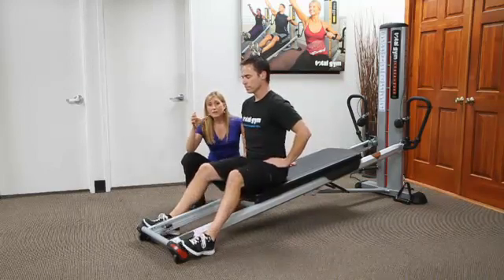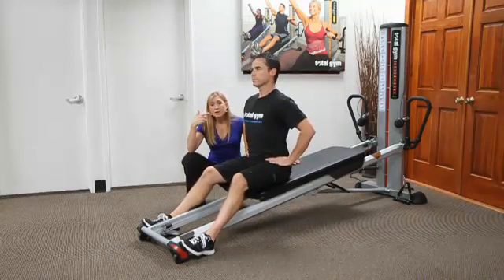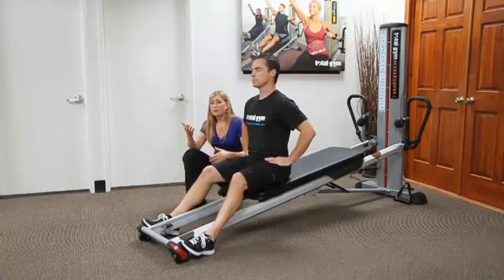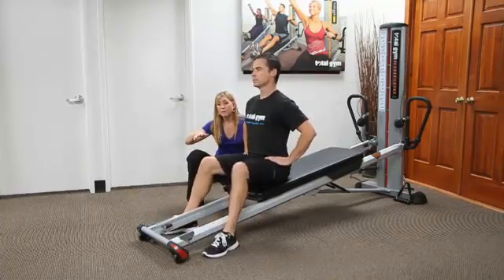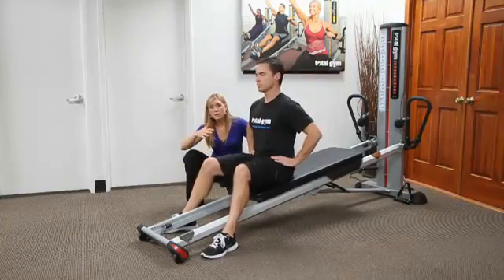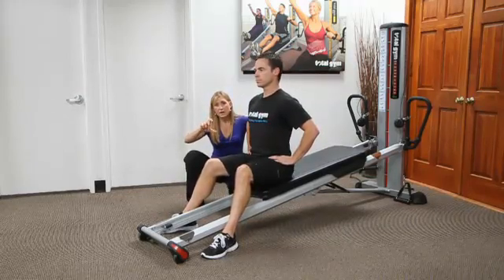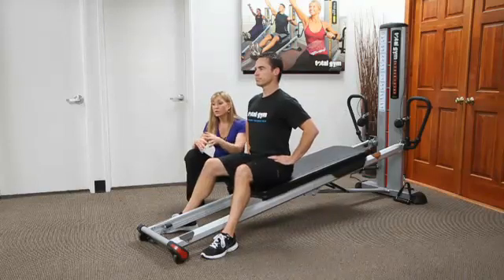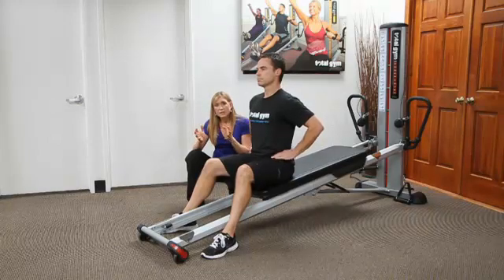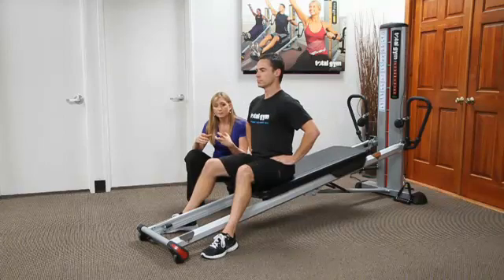And I use the fact that the board moves and he can tuck under and push back to allow him to develop the awareness of movement and isolation of the pelvis. Oftentimes, I really say, let's really move and let the glide board move and really kind of tuck under and back and let the entire body get into the motion, and then really tell, okay, keep the shoulders stable, and then just really start to isolate it out. It's nice because sometimes a ball has too many components. It requires lateral, anterior, posterior stability, and this just can take away one of the components and really allow someone to develop that awareness of how to move their pelvis.